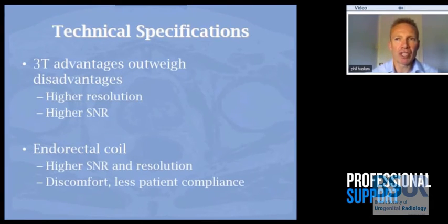3T or 1.5T? Well, if you've got a 3T scanner, great, because the advantages certainly outweigh the disadvantages. You can get higher resolution images, and you get a higher signal-to-noise ratio.